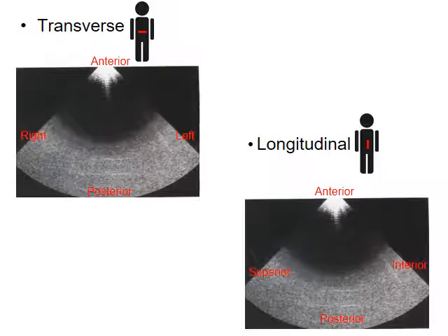So if I've got my patient lying supine on the bed and I want to look in the transverse plane, side to side, I put that dot on the transducer towards the patient's right hand side. And then this will be the orientation on your image. If you think your transducer is sitting here on the tummy, so this is anterior and the sound is going to the back, posterior.